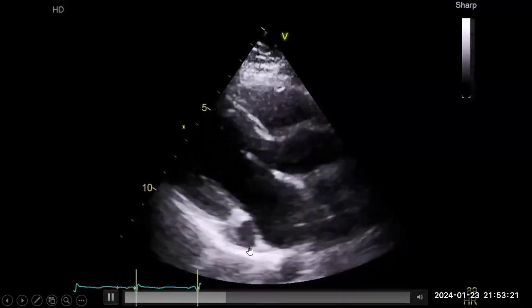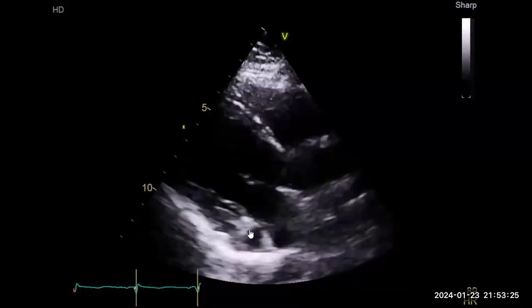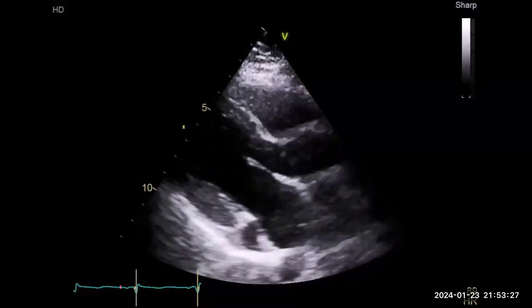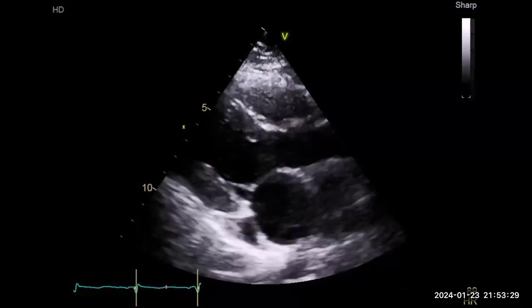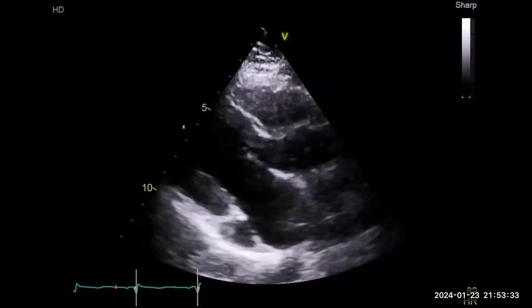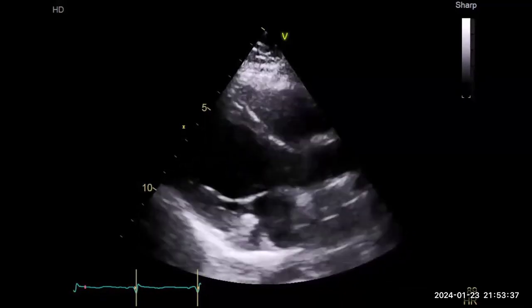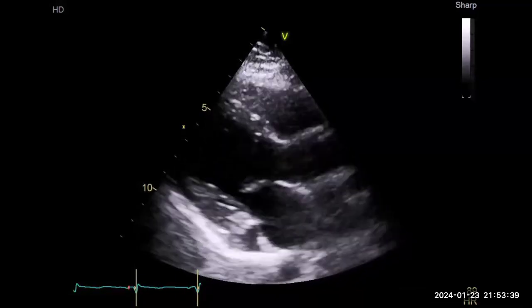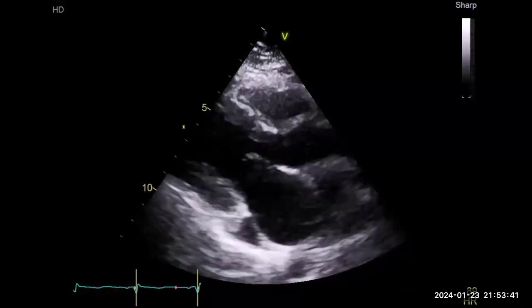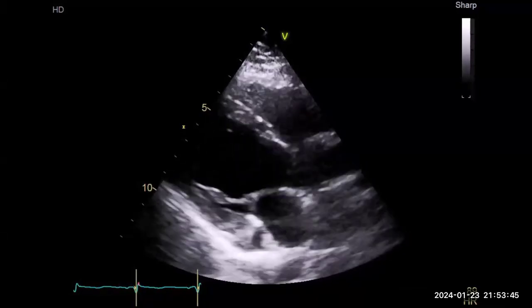I will just correct you. First of all, you have to put the cannula where, Hamid? In the left arm, okay? Left arm, yes, because you are looking for the left SVC. If you put it on the right, the agitated saline is going to go to the right side of the heart. So you insert your cannula in the left arm. You inject the agitated saline, and after that, you look carefully.